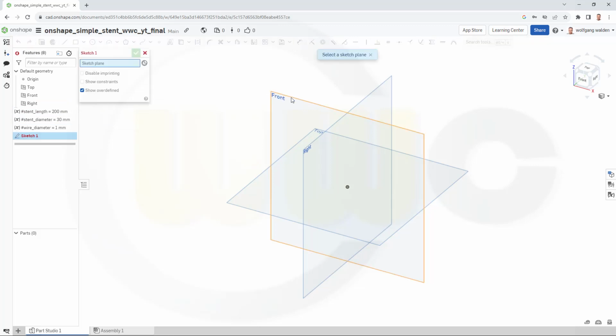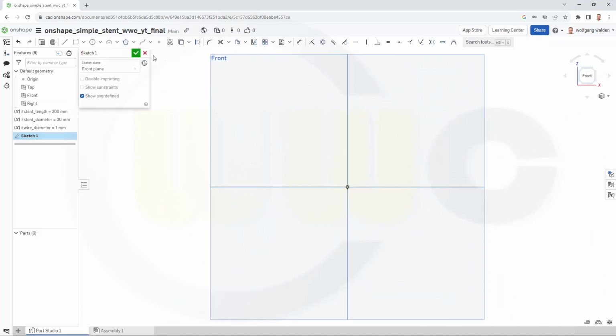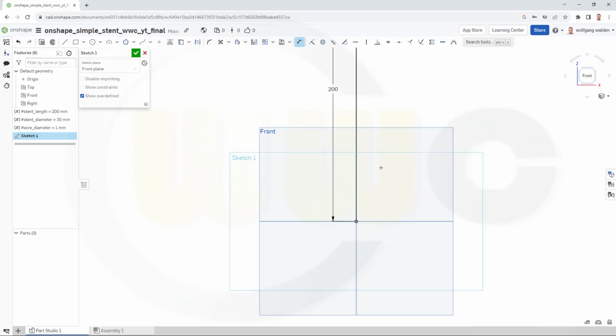Let's start with a sketch on the front plane. I need a line. And the length of this line should be, of course, the stent length. So, give it a dimension, and this should be, of course, the stent length. And it should be a construction line.